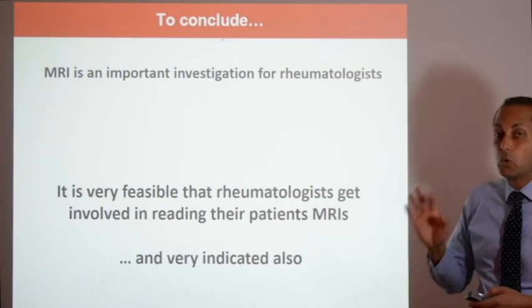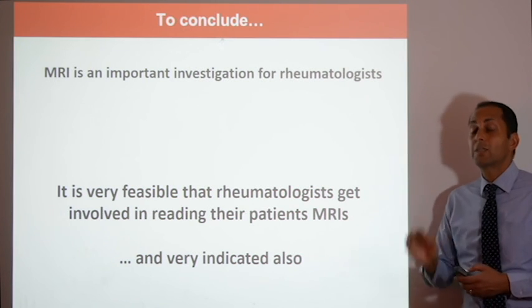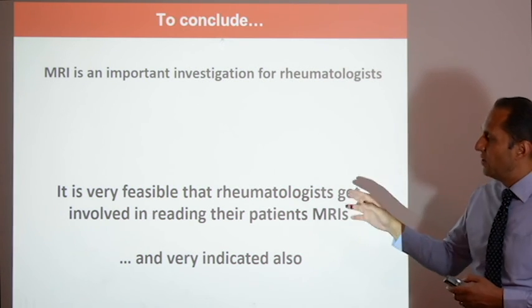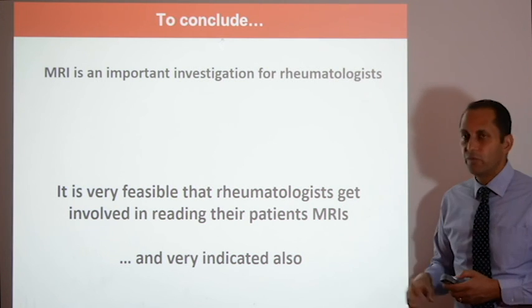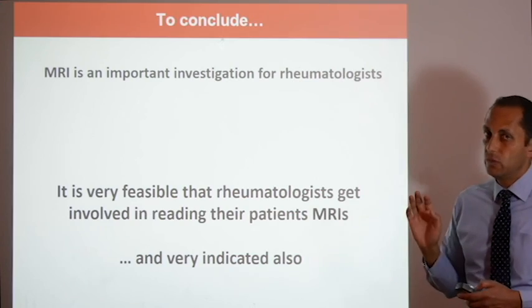So, to conclude, MRI is an important investigation for the rheumatologist. It's quite important. It is very feasible that the rheumatologists get involved in reading their patients' MRIs, and it is very indicated also, as we just mentioned.